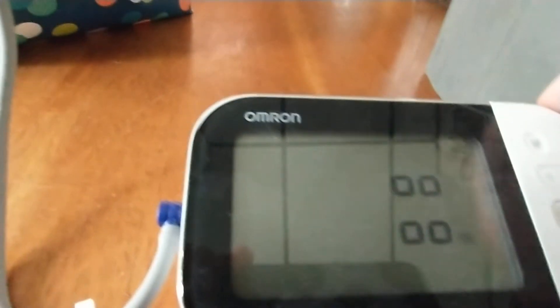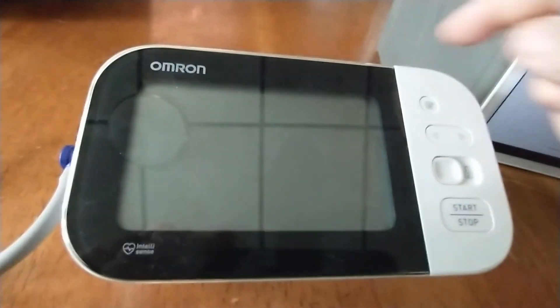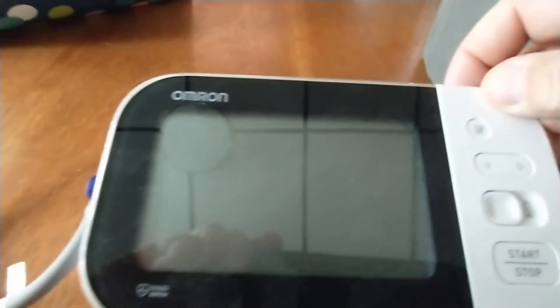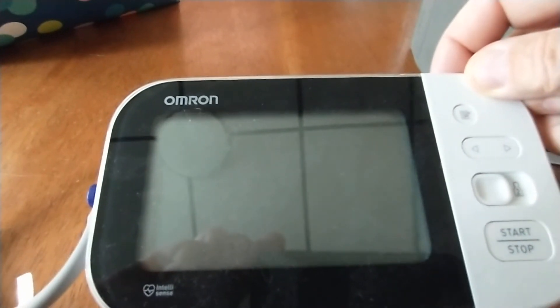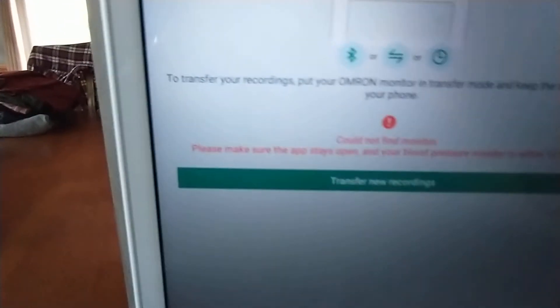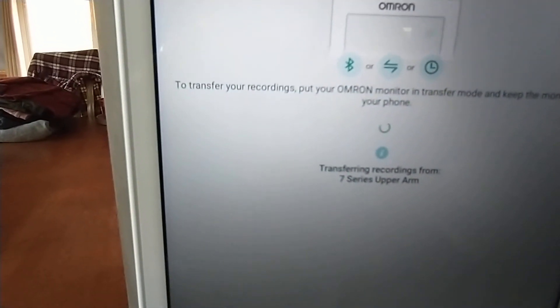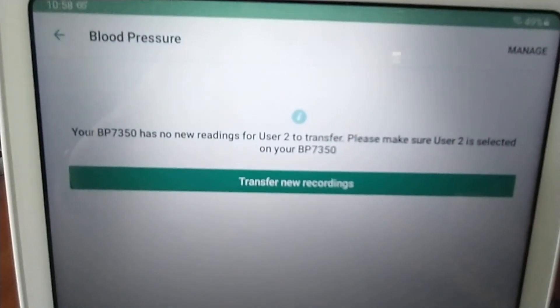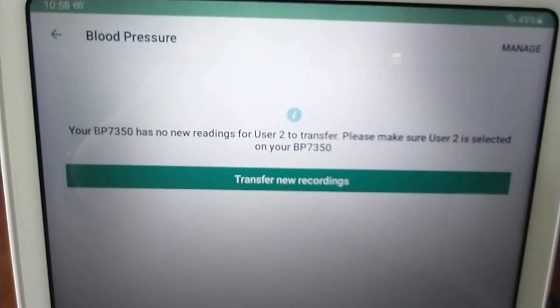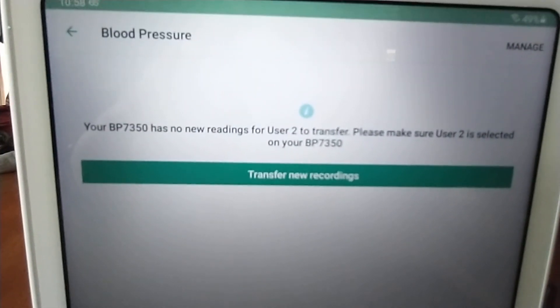Let's go back to the monitor. Turn it off — press the Start/Stop button. Then press one short press on the Bluetooth button at the back. Now you get the little O and it's flashing. Go back to the app, hit 'Transfer New Recordings,' and bingo — it works. Now in my case I've got everything loaded up so there's nothing new, but if you had new readings this will transfer to your tablet or your phone.